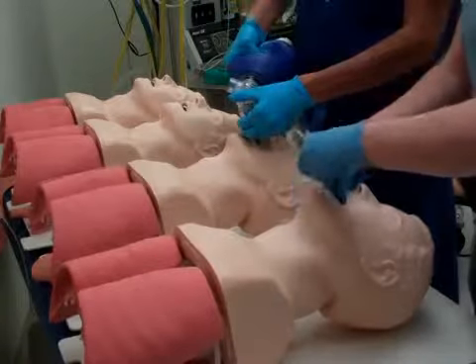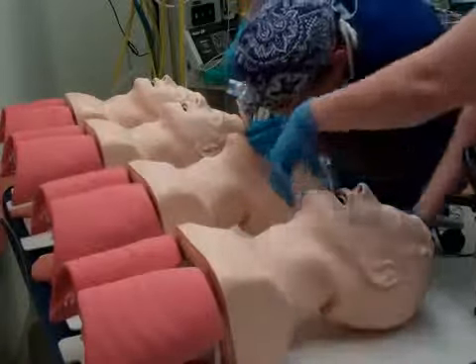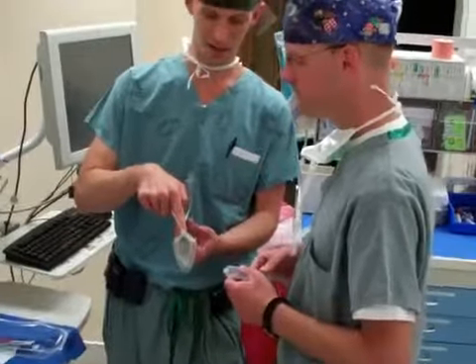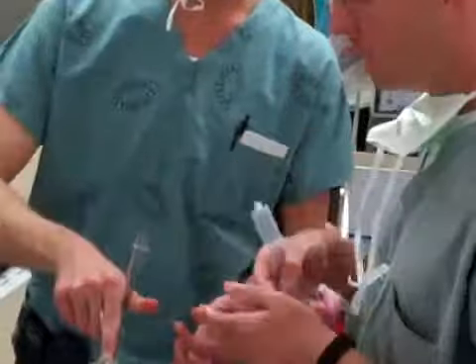Additional familiarity with the laryngeal mask airway can be gained with practice on a training head model, on a patient simulator, or on real patients in the operating room under the guidance of an anesthesiologist.